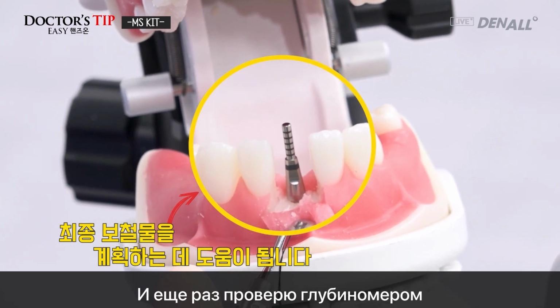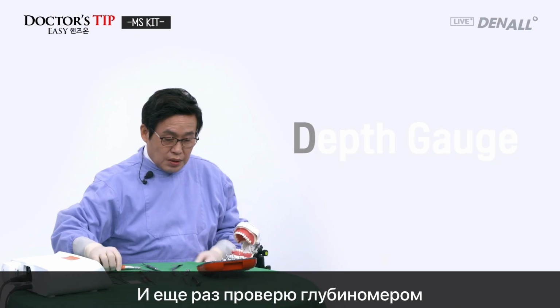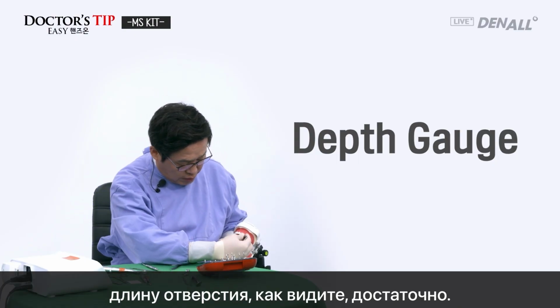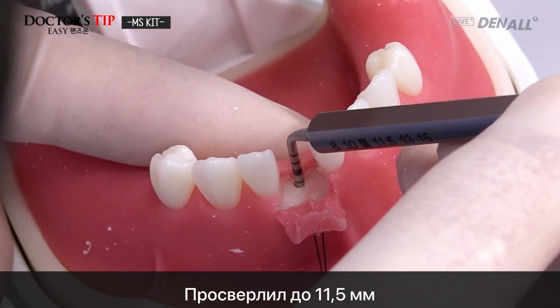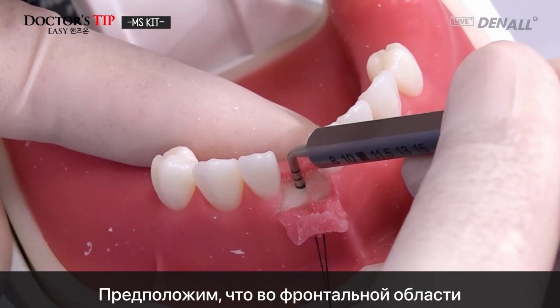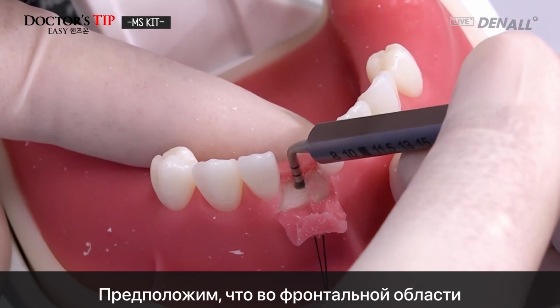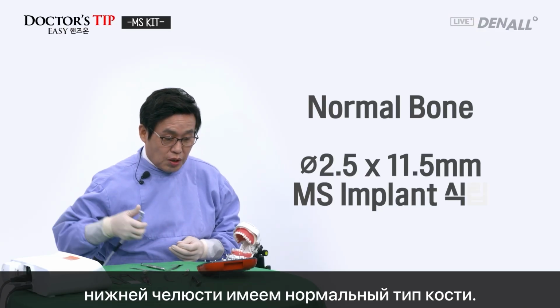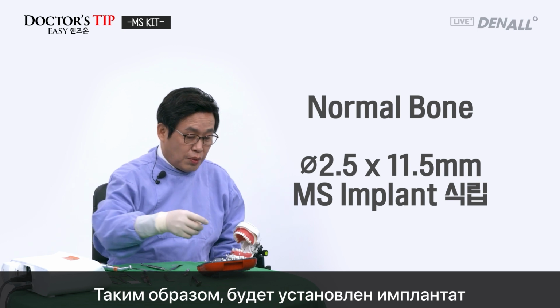So it's a better guide pin for doing that. Again, I'll check the depth with the depth gauge. And as you can see, it's sufficient, drilled up to 11.5 millimeters. And then, in the lower anterior side, let's assume it's normal bone.